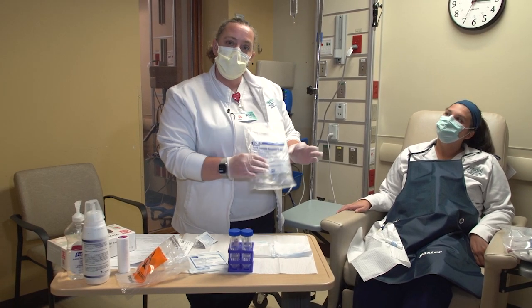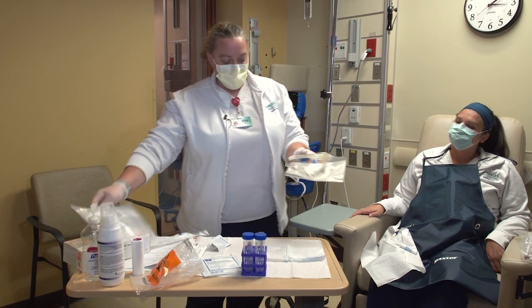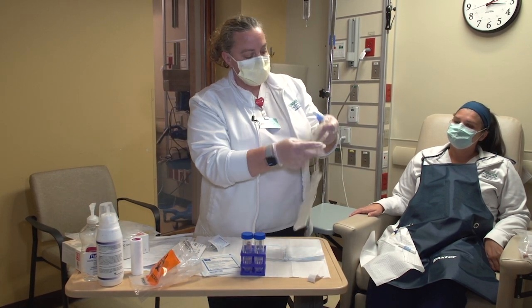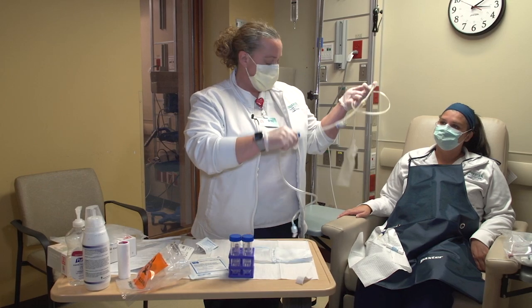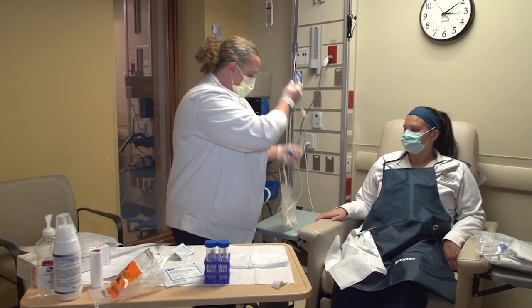After 2 hours, you're going to use a manual drain bag. On your manual drain bag, there are 2 connections. Just remember that the short one is the one that you're going to hook to your patient. Clamp both lines and have that ready.